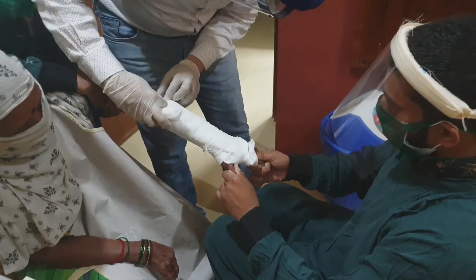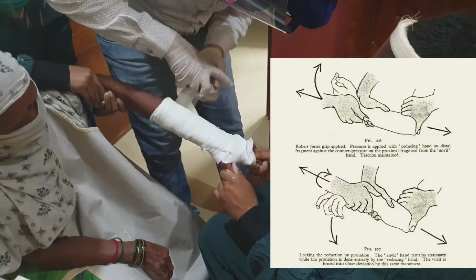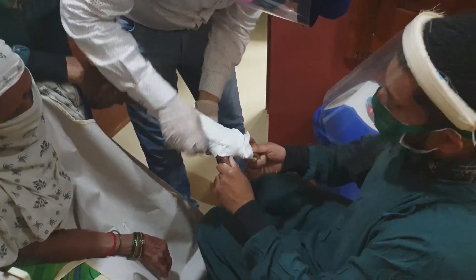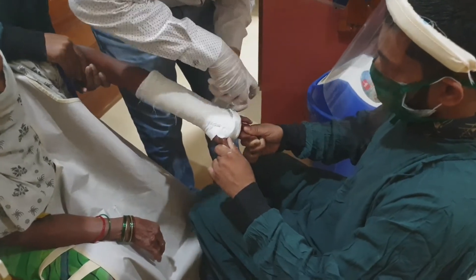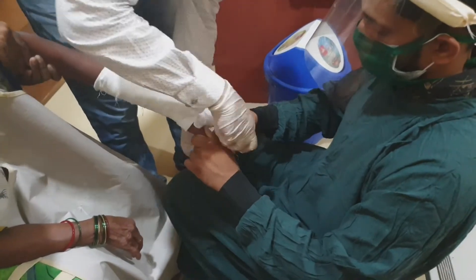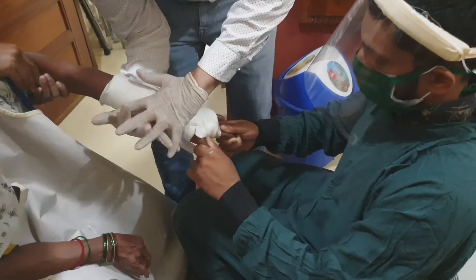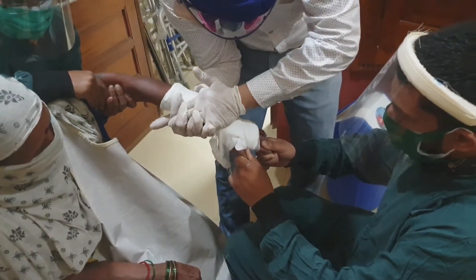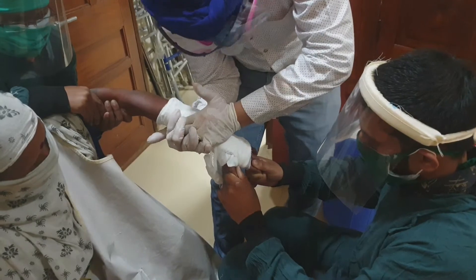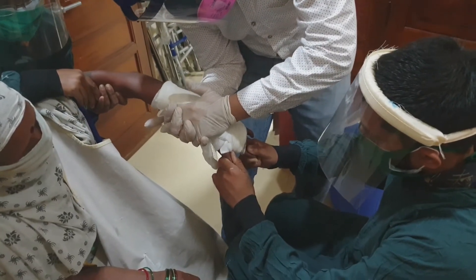Always leave the little finger free while giving traction, and keep holding the fracture volarly and dorsally so that it doesn't further displace. Always explain to the patient the precautions of plaster carefully so that they don't land up in complications.